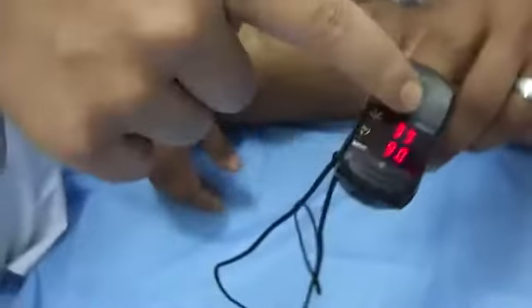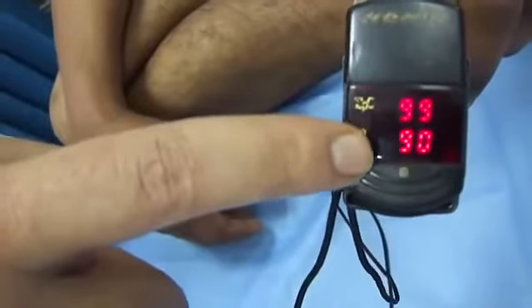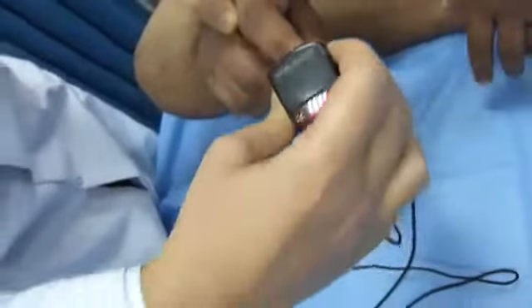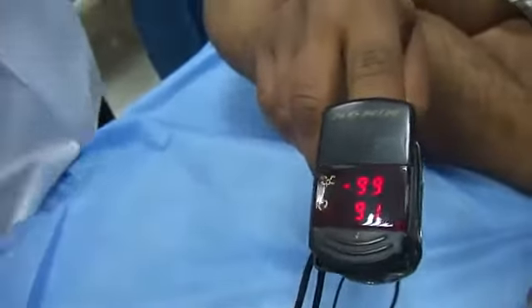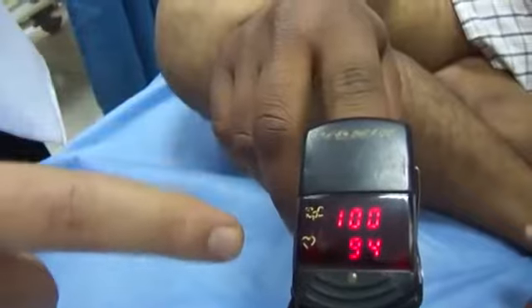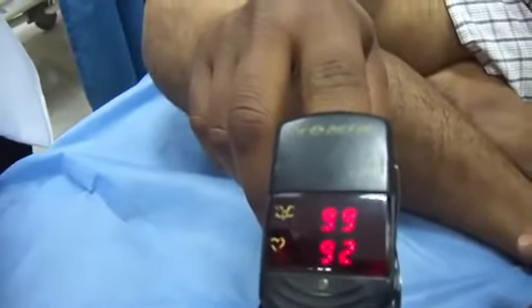This is the 99, and this is the pulse rate, which is 90. And then you have to check the contralateral side. Also, it is calculating now. It is also 99, and the pulse rate is now 92.